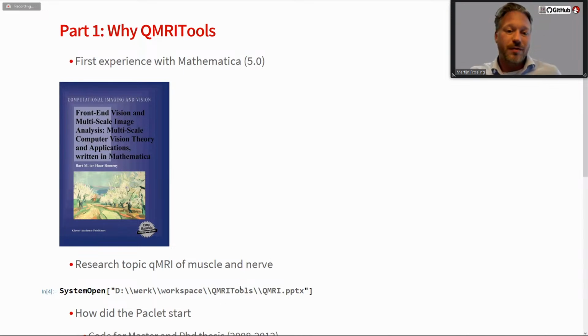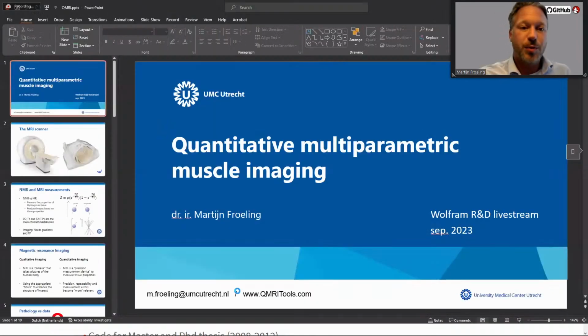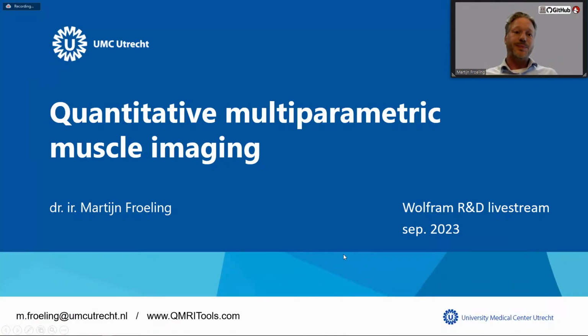And before we dive into all the Mathematica stuff, I quickly wanted to give you a quick overview about what we mean by quantitative MRI, and especially of muscle and nerve. So for that, I'm going to quickly switch to a PowerPoint presentation.